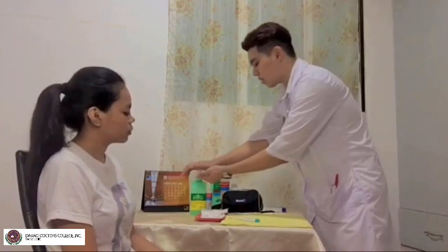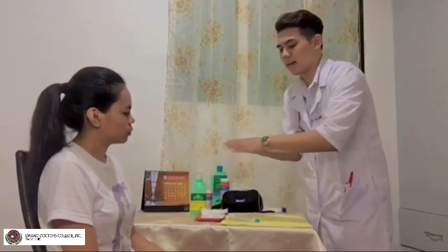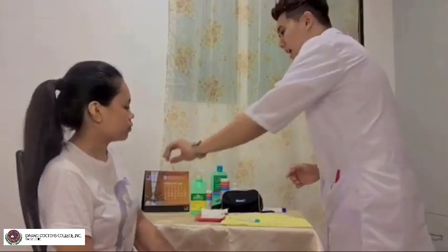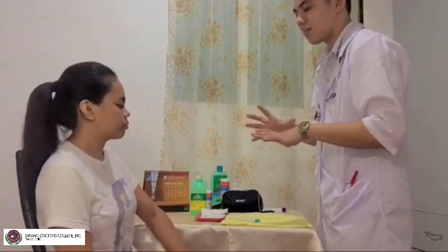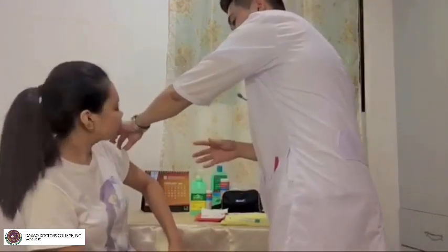So, of course, before doing this procedure, we need to have a proper hand hygiene. And using this alcohol, I'm going to sanitize my hands. And then, the first one will be move the gown or sleeve away from the arm and shoulder and raise his arm away from the torso and inspect the axillary area for lesions or perspiration. So now ma'am, need na ko itaas imuhang kaning diri na part sa sanina tapos i-check na ko imuhang armpit kung naay mga samad-samad or singot-singot. Okay lang ma'am? Sige.